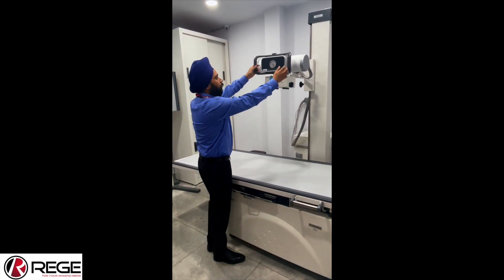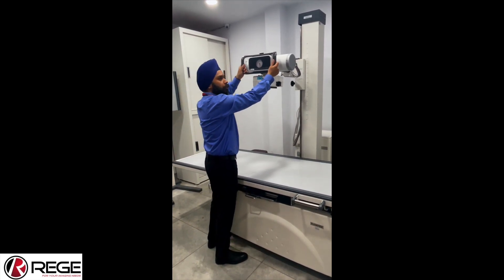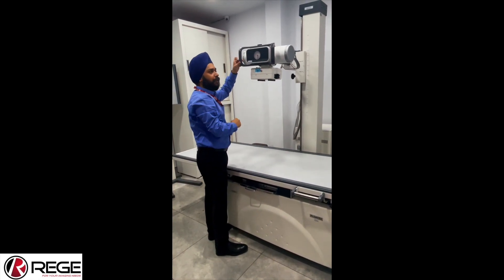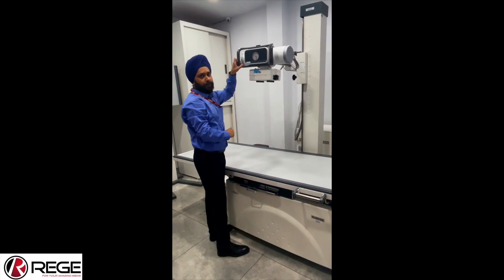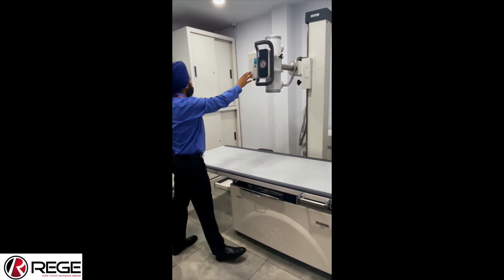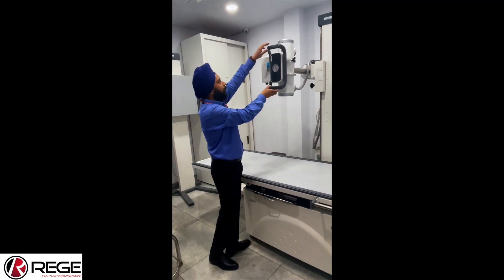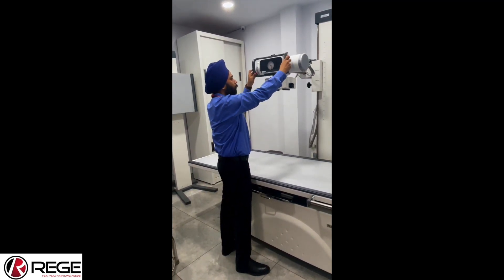Now I will show you the third movement, which is the telescopic. Here we can do the telescopic movement — very smooth, very convenient. With a single finger I can move it, so you don't have to apply any force. Now I will show you the movement of the tube head rotation. We can rotate it — so in case we want to do chest X-rays or standing X-rays, we can rotate it like this, and we can move it back if we need to do other positions.